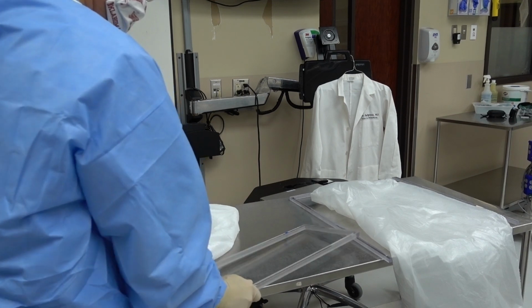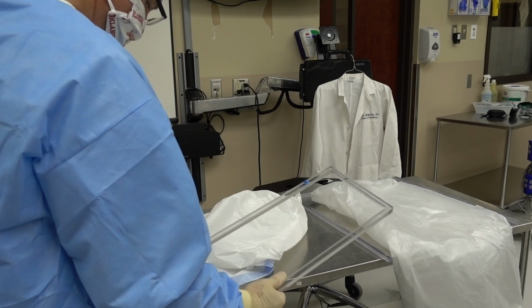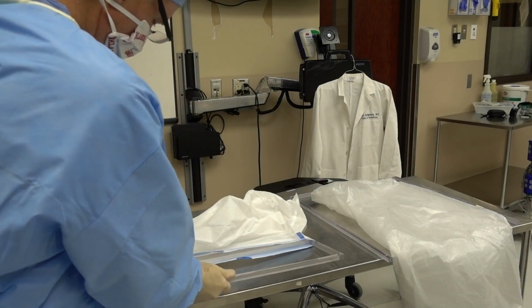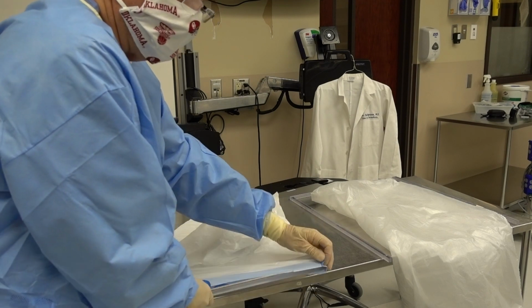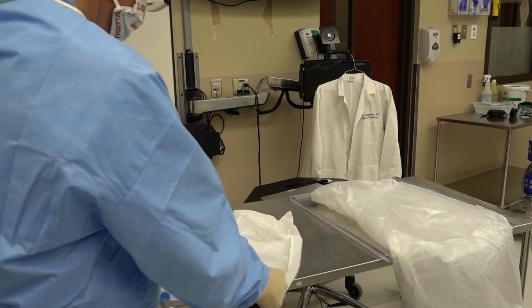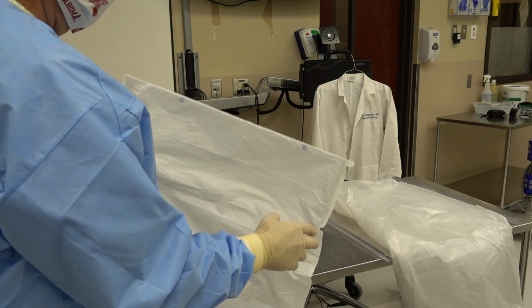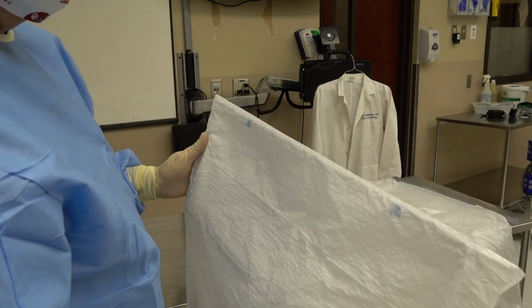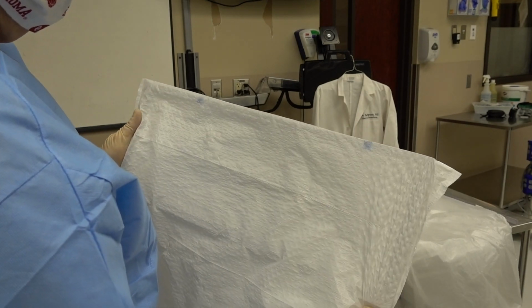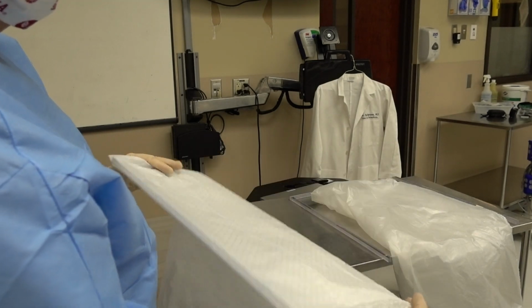So this is a 1/2-inch retaining ring. And the bag is placed inside of it and then slipped into the front groove. This has been routed out. We'll probably make these with the machine shop, this part, because it's important that they fit well, and important that you can flip it around or put it at any angle you want. When I got this from the plastic fabrication shop, it had to go in a certain way to fit, and I want them so we can put them in either way and they'll fit.